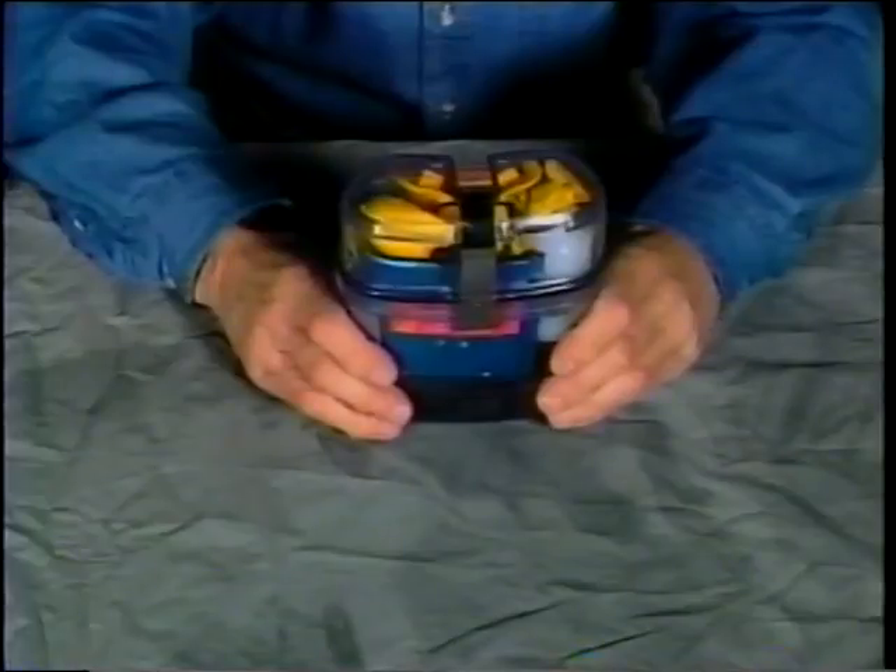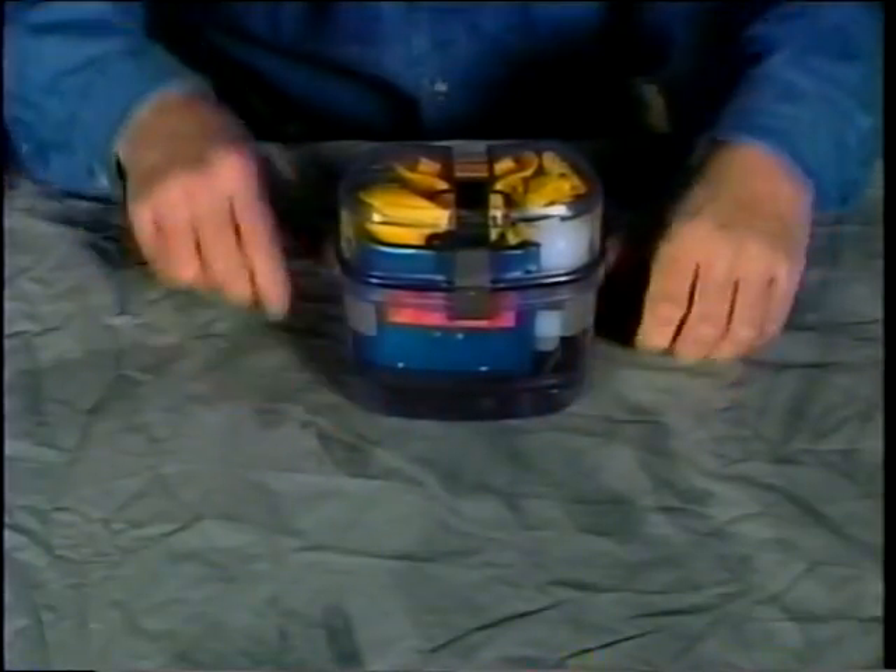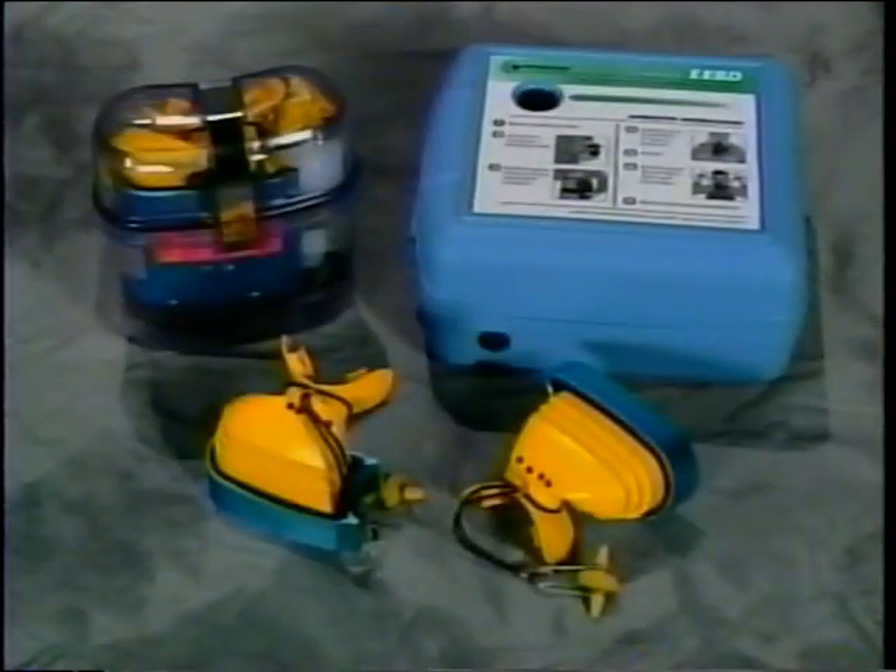The training unit is now ready for the next training session. Each M20 training unit is supplied with two additional mouthpiece assemblies to allow three trainees to use it before needing to clean the mouthpieces. The training unit is also supplied with one light blue secondary container.